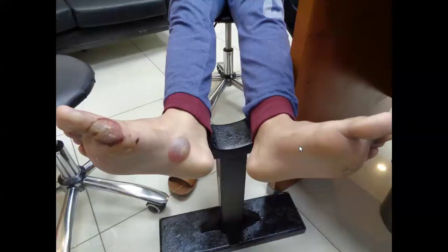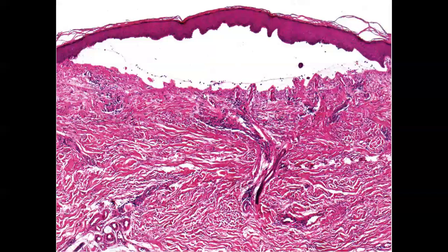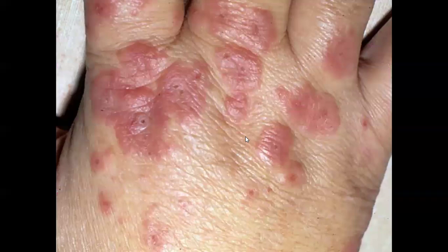This is a kind of blister which is iatrogenic. The blister is induced by cryotherapy, and all the iatrogenic blisters will be clean blisters, subepidermal, like we see in EBA. So no significant inflammatory infiltrate unless the blister is infected.